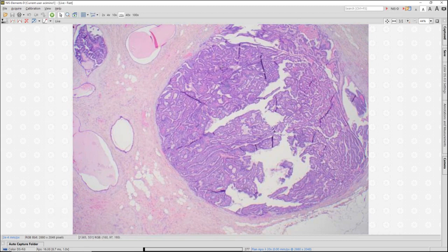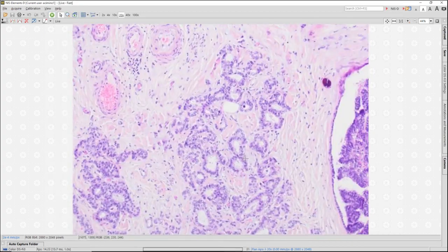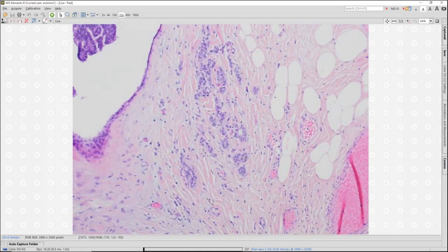Right? So those are a lot of words to say that encapsulated papillary carcinoma, papillary DCIS, the entire size of that is still considered and managed as in situ. Only the size of the conventional invasive mammary carcinoma contributes to the size of the patient's stage. So in this case, it would be T1a. Okay.